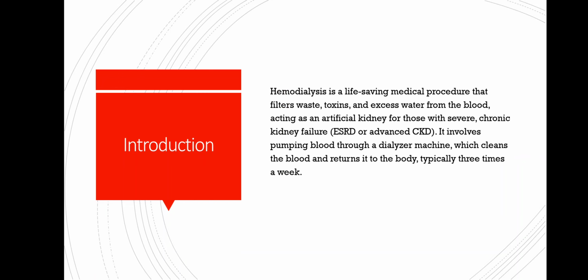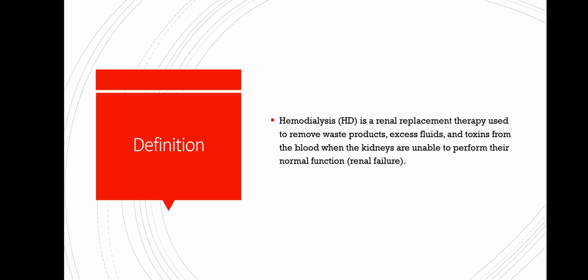times a week. Then, definition of hemodialysis. Hemodialysis is a renal replacement therapy used to remove waste products, excess fluid, and toxins from the blood when the kidneys are unable to perform their normal function.